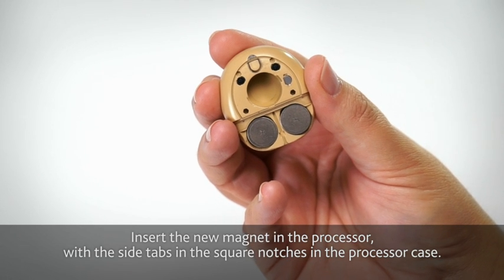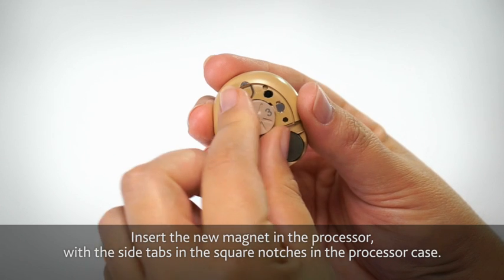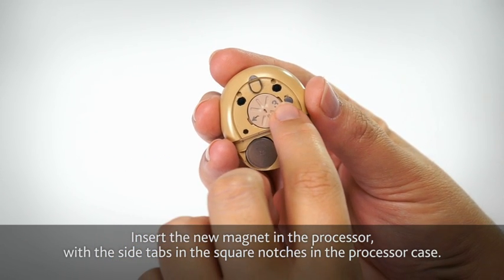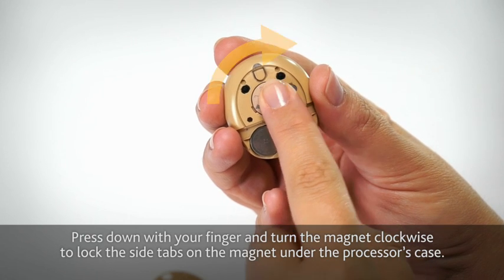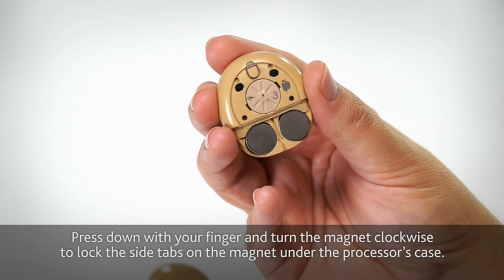Insert the new magnet in the processor with the side tabs in the square notches in the processor case. Press down with your finger and turn the magnet clockwise to lock the side tabs on the magnet under the processor's case.